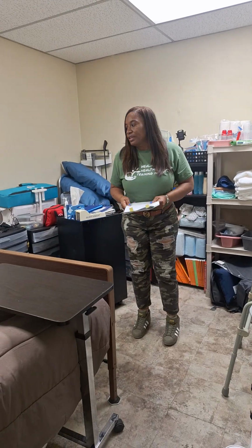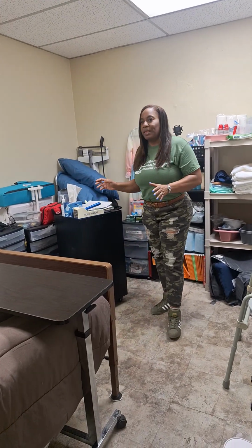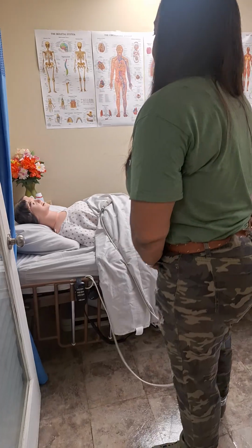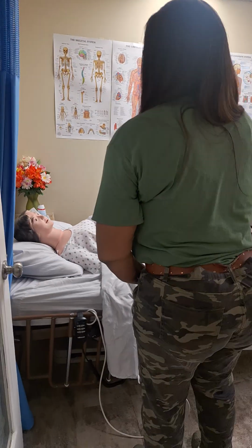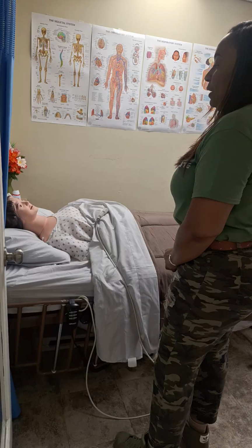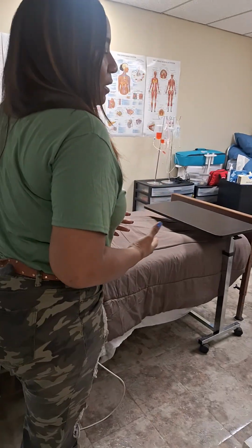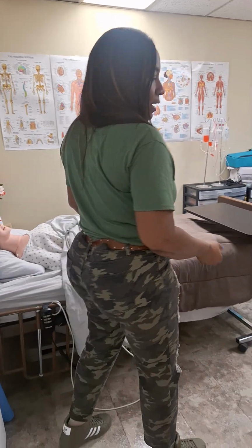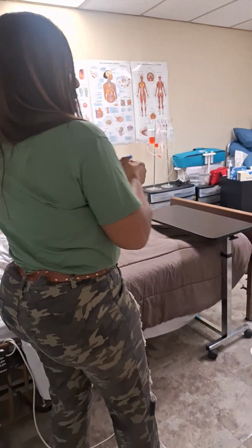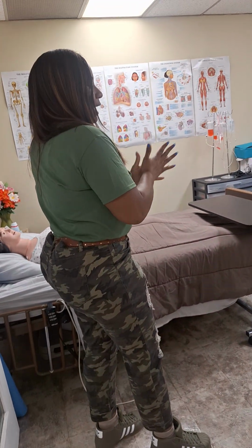So one of the first things you're going to do is gather your supplies, and it's going to look a little something like this. I'm going to knock on the door. Good afternoon, Miss Allen. My name is Tanita. I'll be your CNA. I'm here to do your catheter care. Is it okay? The patient has given me permission to come in and do her care. The first thing I'm going to do is my hand hygiene until my hands are completely dry.